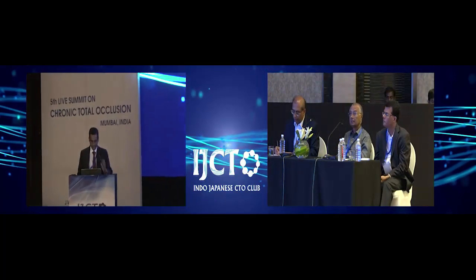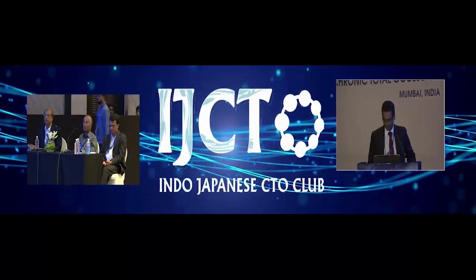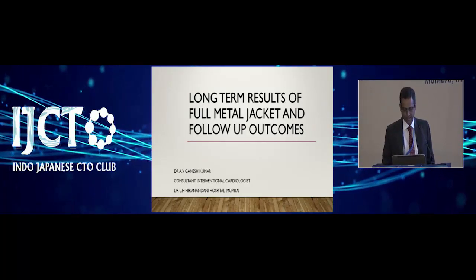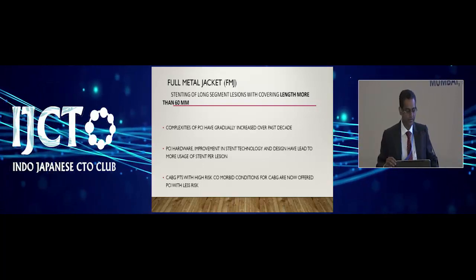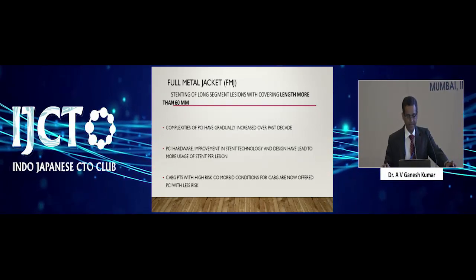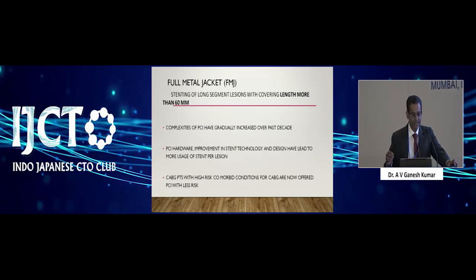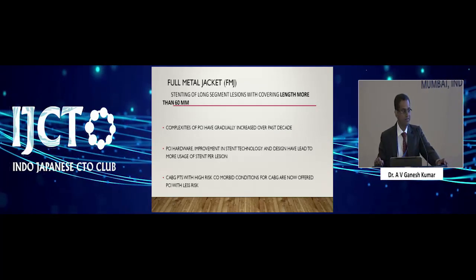Thank you, Chairpersons. I thought this topic was quite relevant for today's meeting because whether CTO or not CTO, we've been using a lot of stents and doing a full metal jacket. By definition, the full metal jacket is when stent lengths are more than 60 millimeters.